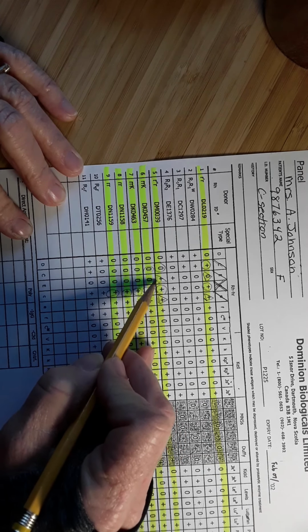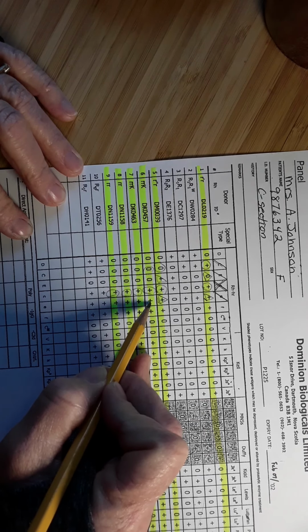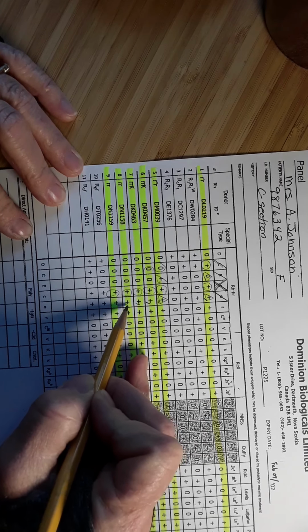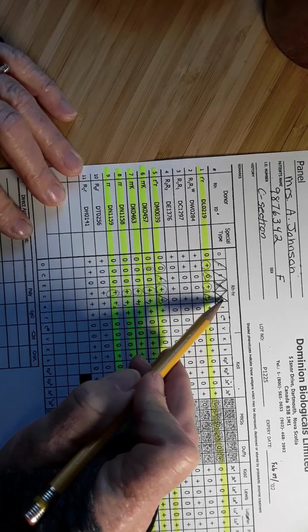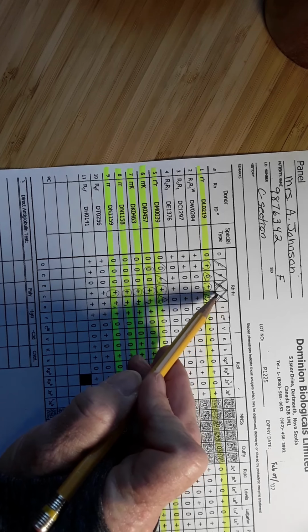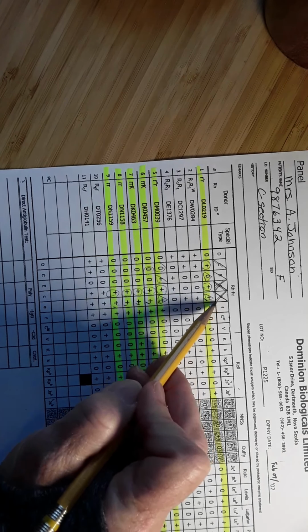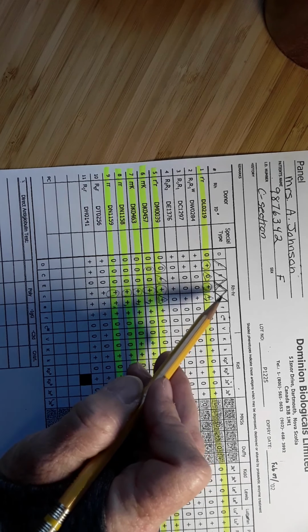This is a heterozygous cell, so not as convincing evidence, but lo and behold, if I continue down, I've got little e homozygous cells that are not reacting, so I've got my second slash. My first slash is that I found a cell that meets the criteria on page 9, step 3, and my second slash means that I found a second cell that finishes off that criteria.